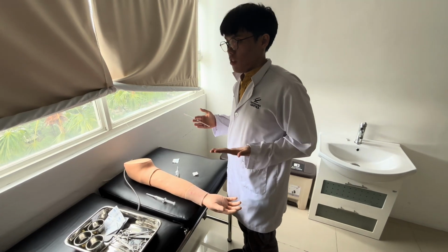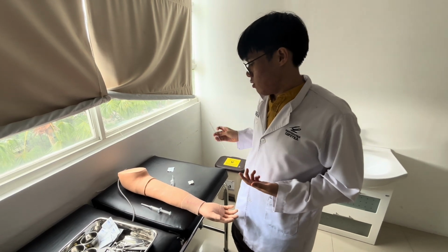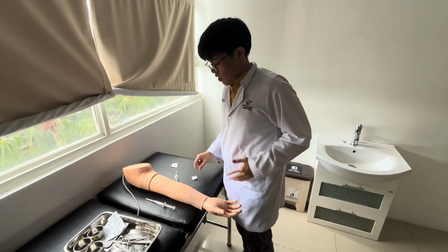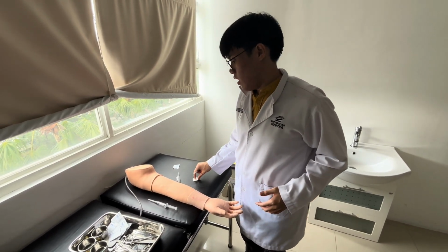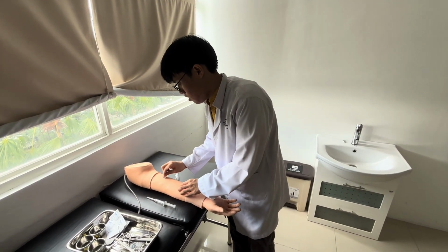Okay, so next up is the intradermal. So for intradermal, we use the small needle. So first what you do is, again, use an alcohol swab on the area you want to puncture. So let's say around here again.